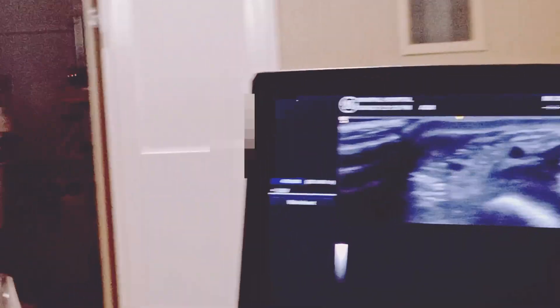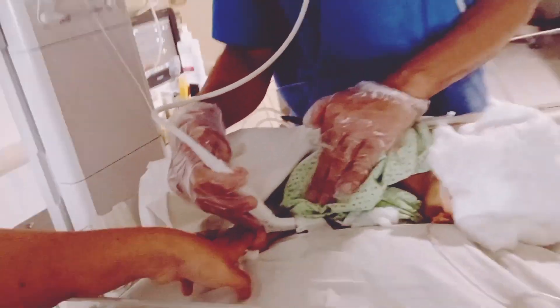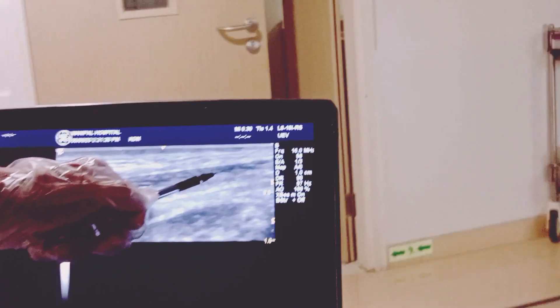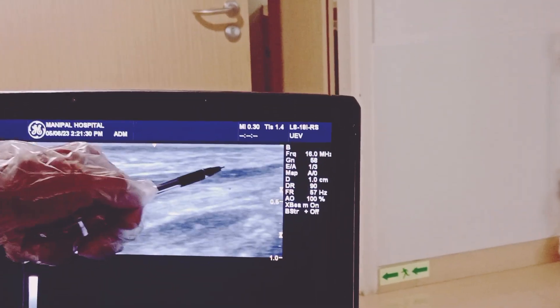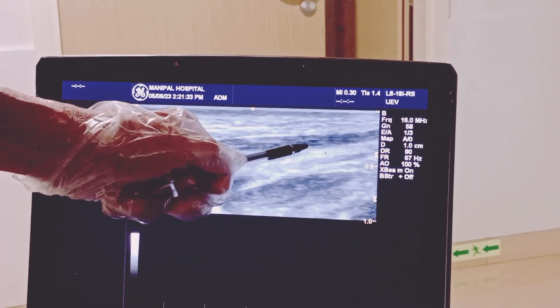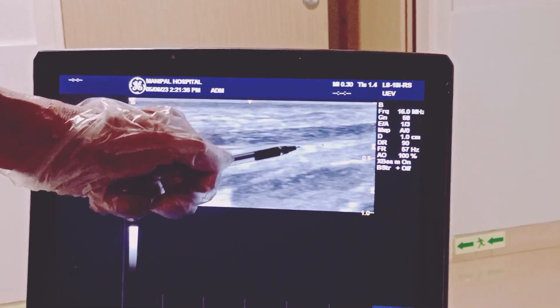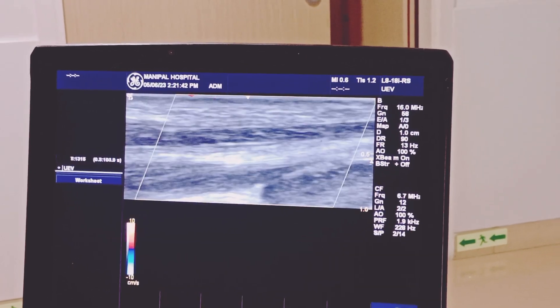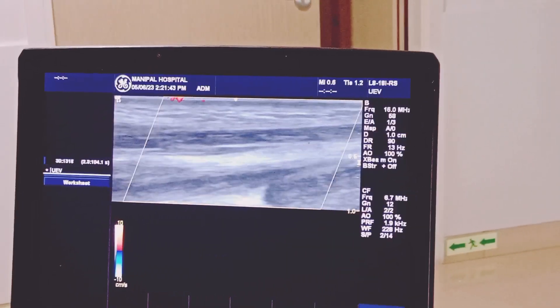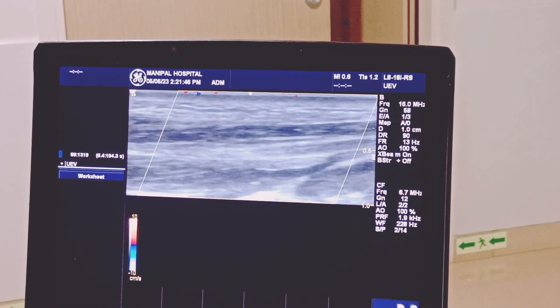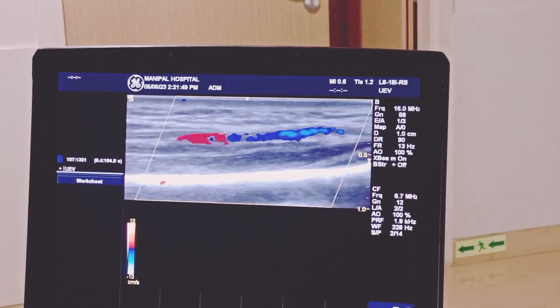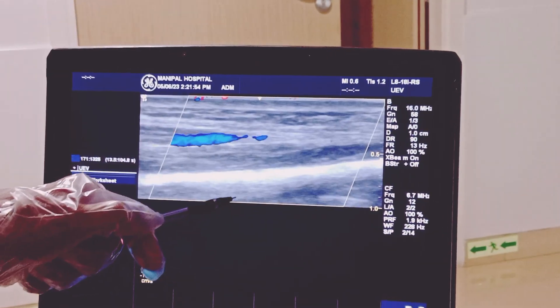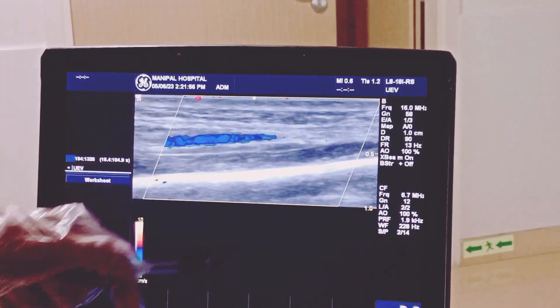Now I will rotate to the sagittal plane — just rotate the probe. You can see the artery there on the longitudinal plane. If I apply color Doppler, you can see how beautiful it is — this is the radial artery with color Doppler on the longitudinal plane.